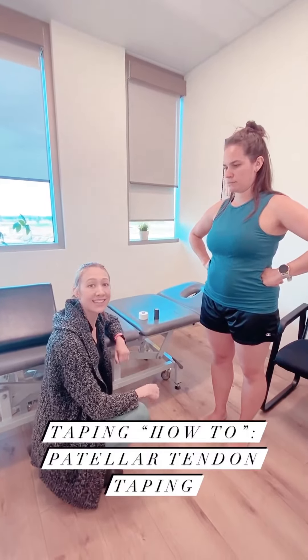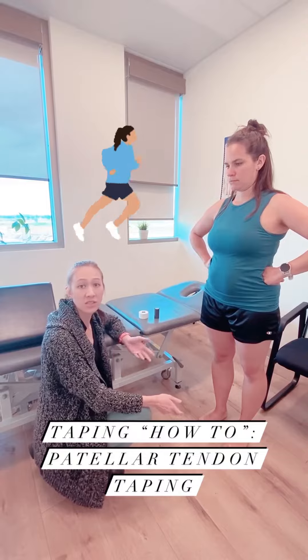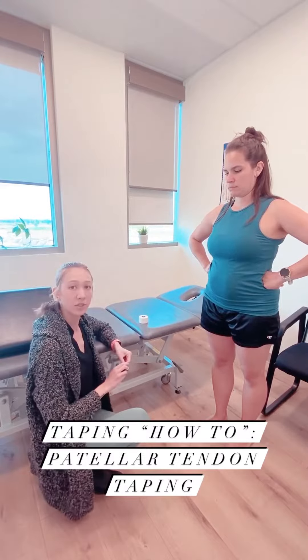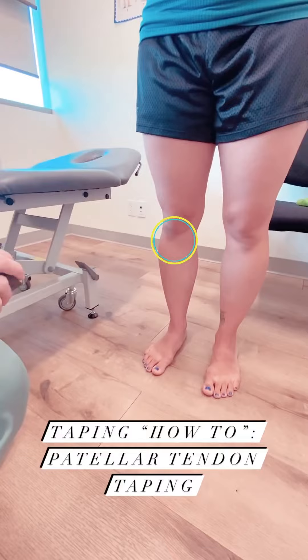We're going to do a patellar tendon taping today. Patellar tendinopathy is common in runners and people who participate in jumping sports, and what this tape job does is it takes a little bit of pressure off the tendon and can help relieve pain.